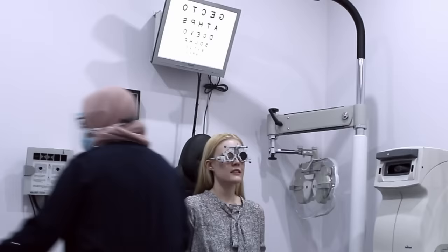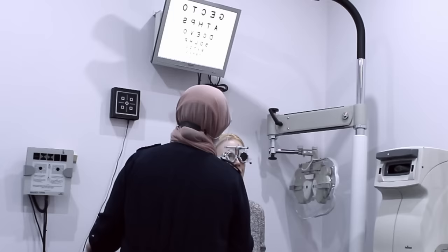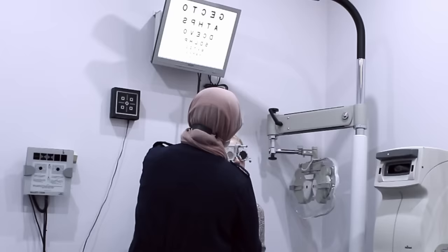Okay, so I'm going to pop that lens in. And can you still see the O, yeah? Now, if you look down to the bottom line, you can see that, can you? Yes. And do you see much difference between this lens and without it? I feel without is slightly clearer. Slightly sharper, yeah? That's fine, good. That's great. Excellent. So I'm going to do the other eye now, okay?